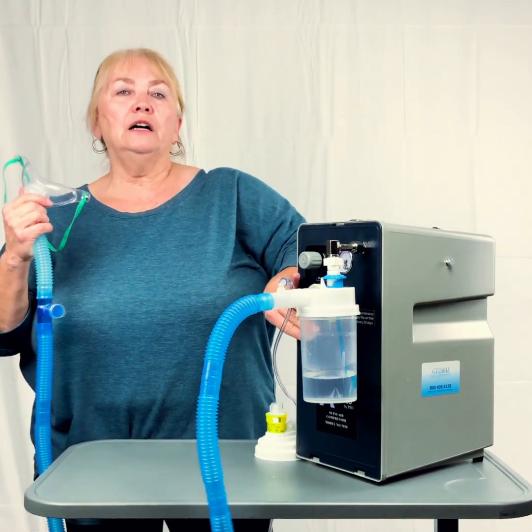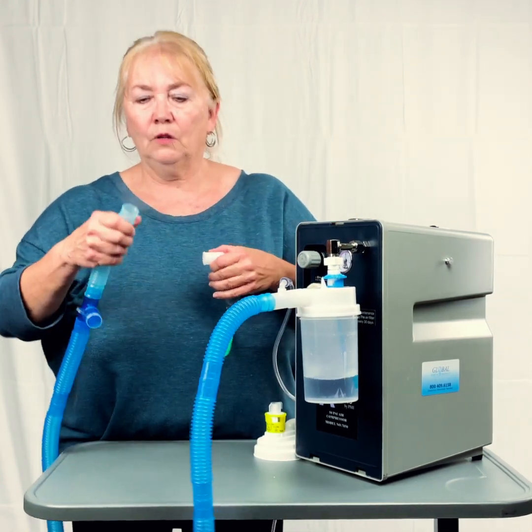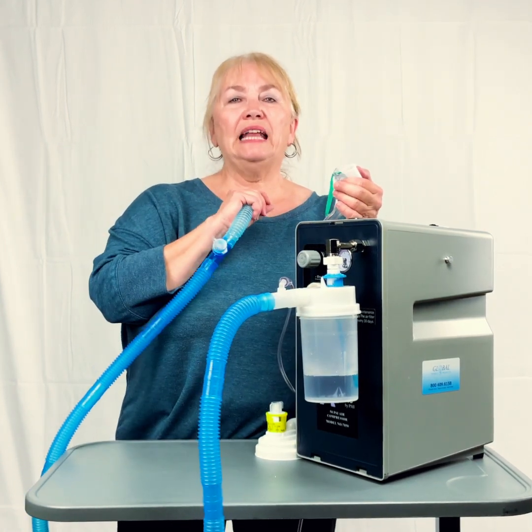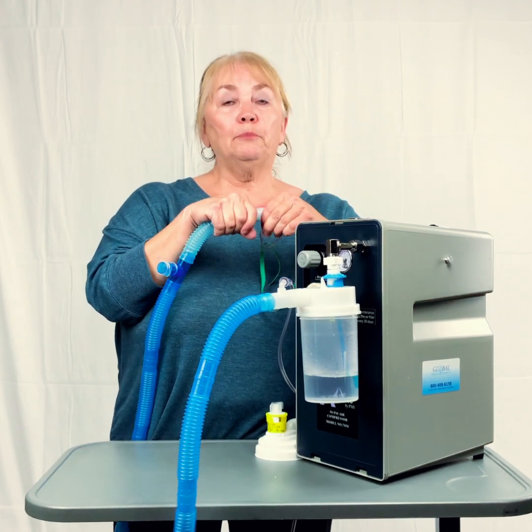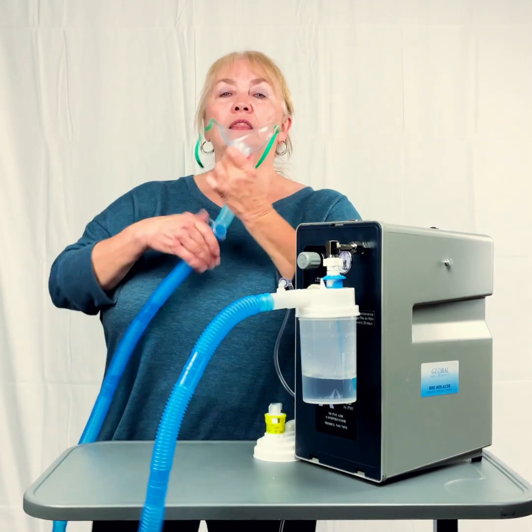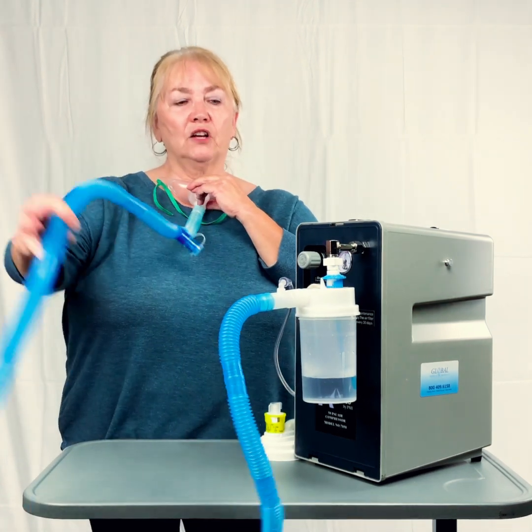So when we turn it on, we want to make sure we have adequate mist coming out of the end. How we determine what's adequate is when they inhale, you want extra mist, and that provides sufficient humidification to their lungs. So again, the mask goes around the trachostoma, and your person is all set.